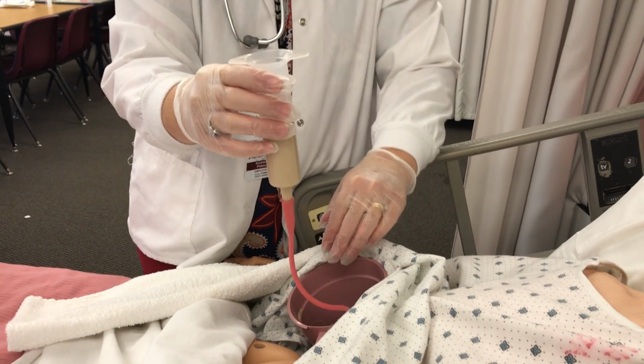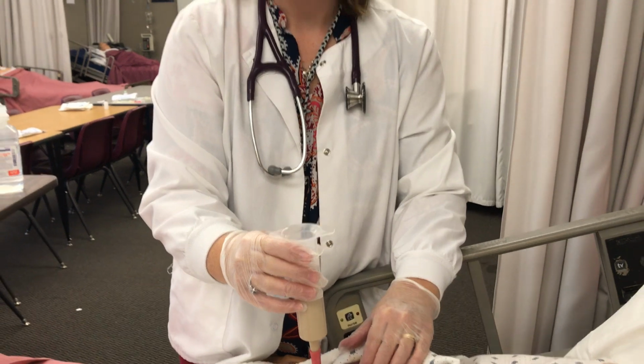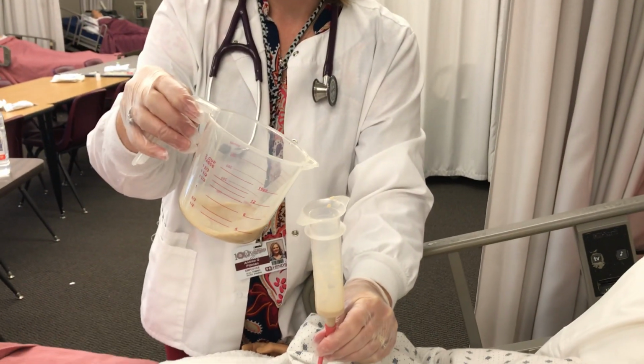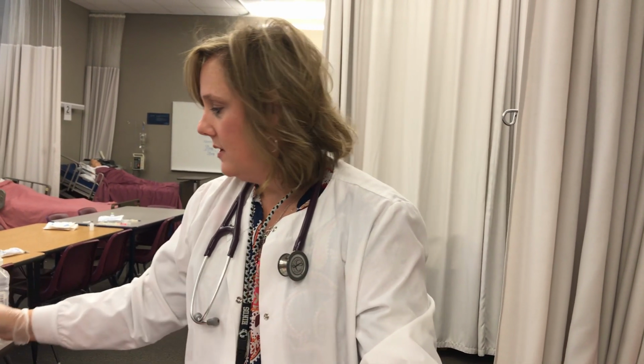Okay, so we've got the feeding, it's gone through, and now we'll need to flush with 50 cc, well, you will put the rest of your 100 cc's in here and let it go. Since this is quite thick with the equipment I'm using, I'm just going to speed up our video because I want you to get just the process of it.